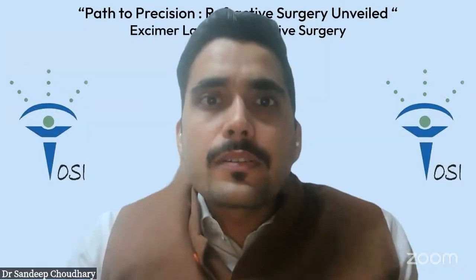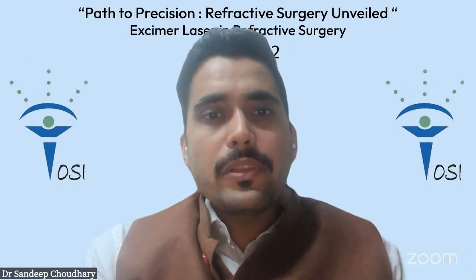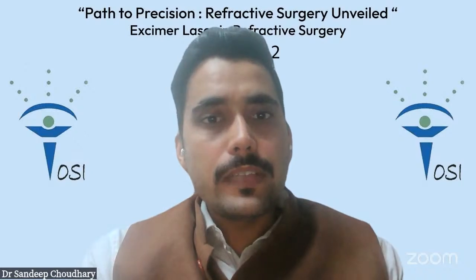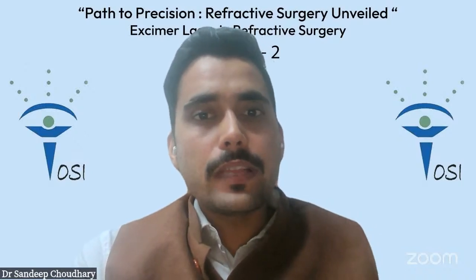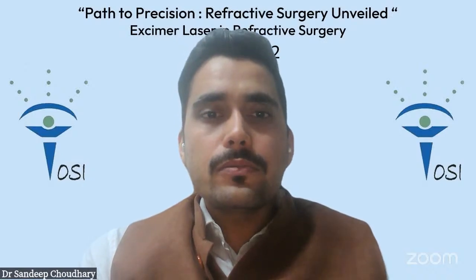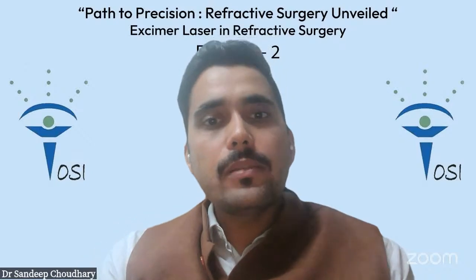Personally, I would always prefer alcohol-based epithelium removal just because I'm more comfortable doing that. As we discussed, what works best in your hands is good. Streamlight also has very good results, but we do not have an epithelial mapping system.